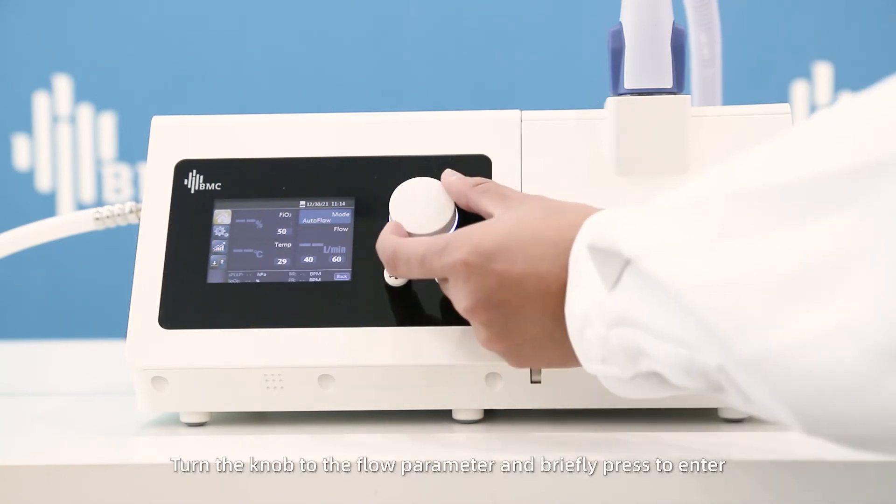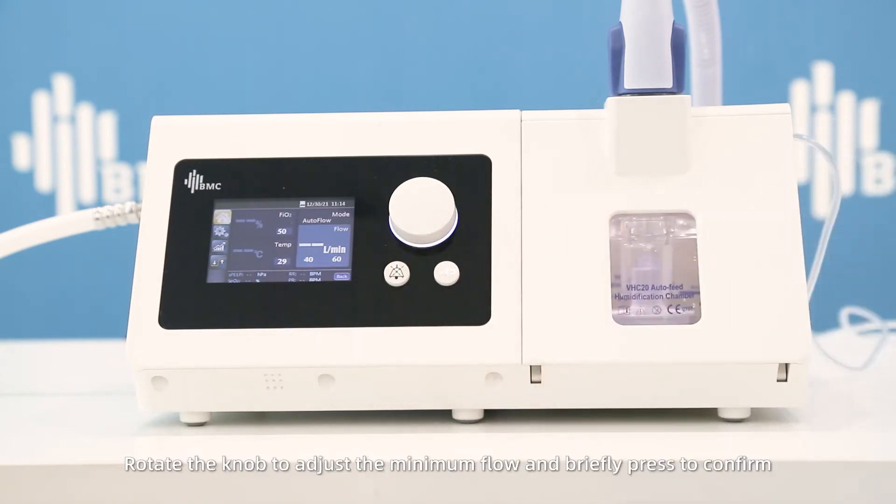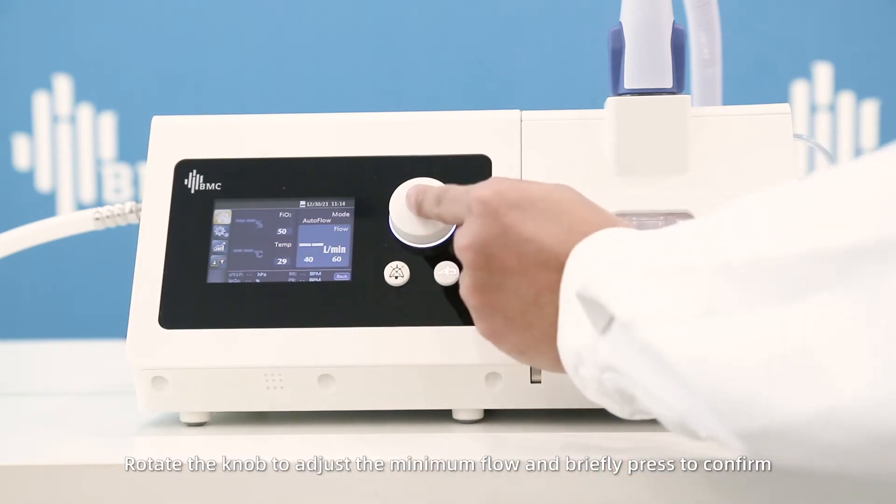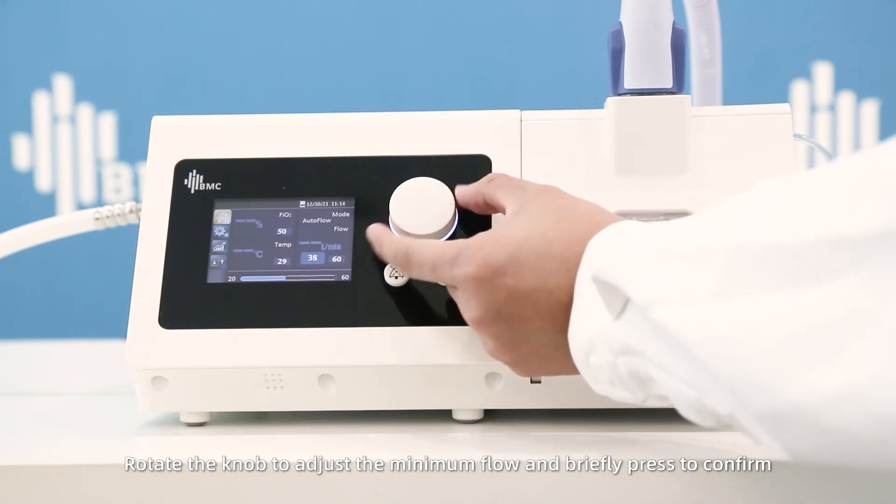Turn the knob to the flow parameter and briefly press to enter. Rotate the knob to adjust the minimum flow and briefly press to confirm.